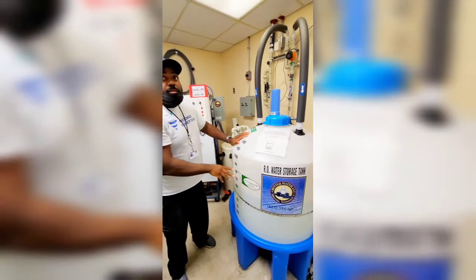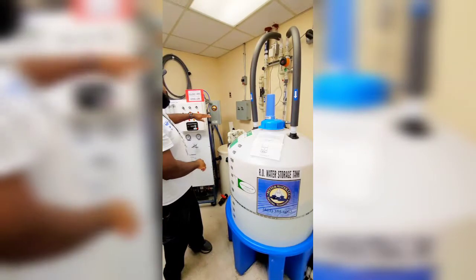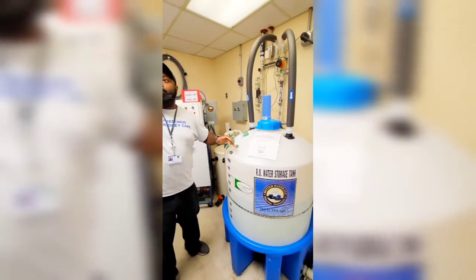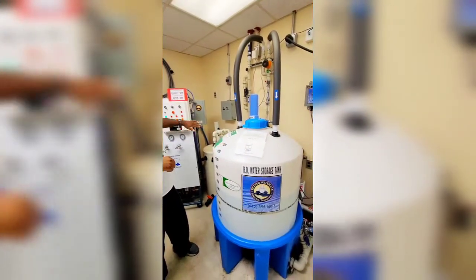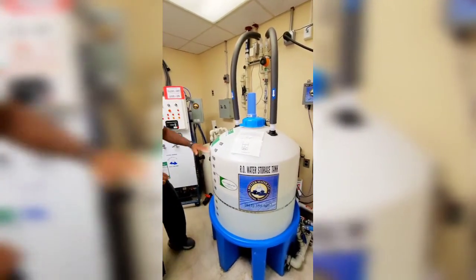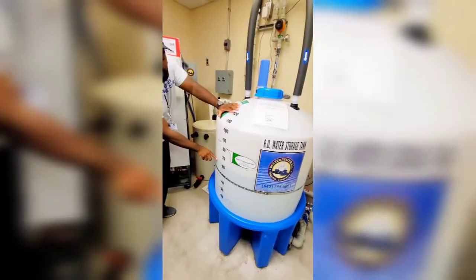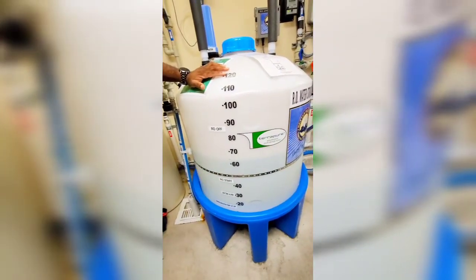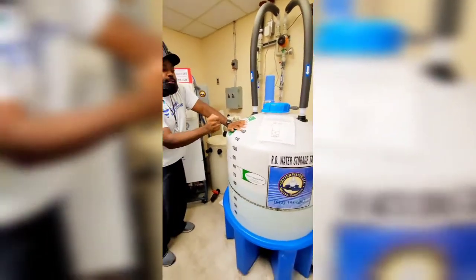This is called indirect feed. With direct feed, water goes from the RO straight to the patients, and if it doesn't get used, it comes back and goes back to the RO. The RO isn't running right now because it hasn't reached the level where it needs to refill the tank. You'll see right here where it says RO start — when the water level gets down to there, the RO will automatically kick on and start purifying water and sending it to the tank.